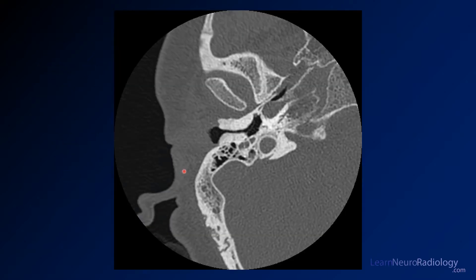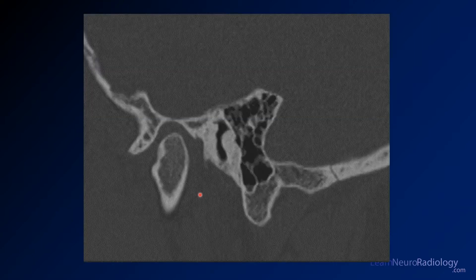Here you see the images from the right temporal bone. Where the EAC should be, you have a proliferation of bone. You can see a little wisp of the tympanic membrane, but this is markedly narrowed from normal. On the sagittal images you see the same thing — the EAC has been narrowed in the AP dimension, with a lot of bone along that external auditory canal.